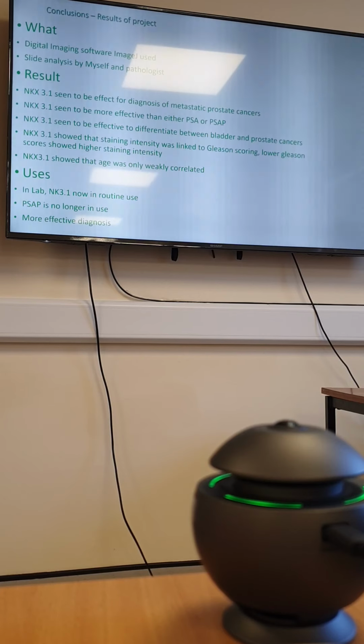You might ask, what's the point of doing all this project? What's the benefit to the lab in any way, shape or form? Well, since the project, NKX 3.1 has been put into routine use, and it's been helpful for diagnosing. There have been quite a few cases recently. Ruben was doing a case that was a cell block, and he tested it for PSA and it came up negative, but then he tested it for NKX 3.1 and it came up positive, and he was able to get a prostate metastatic diagnosis as a result.